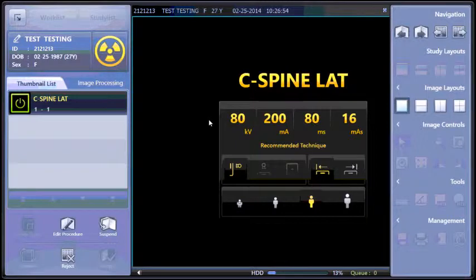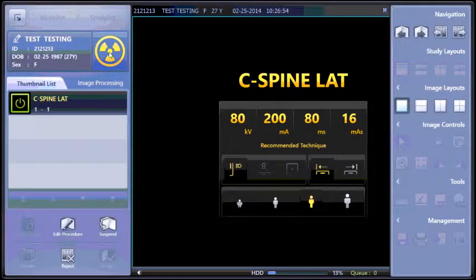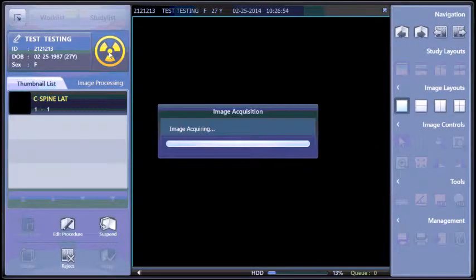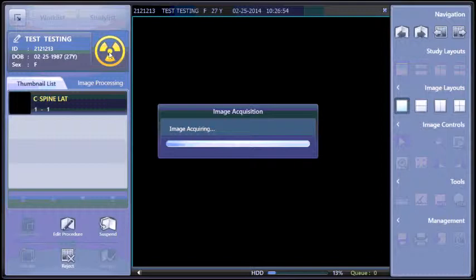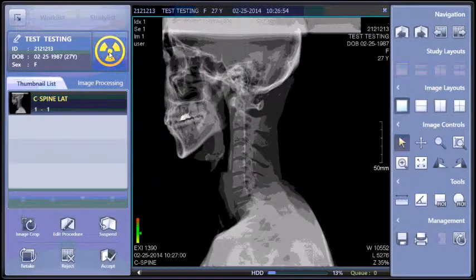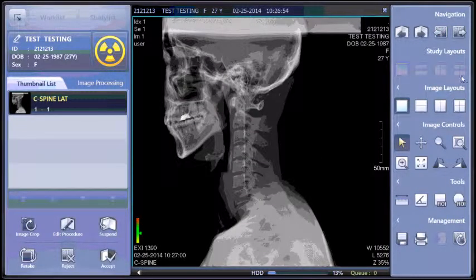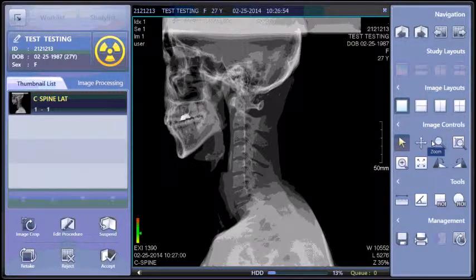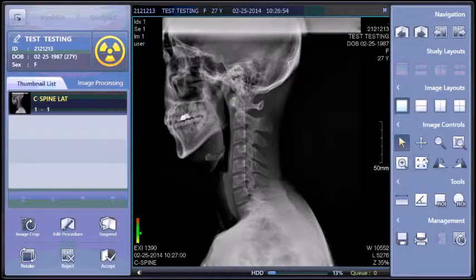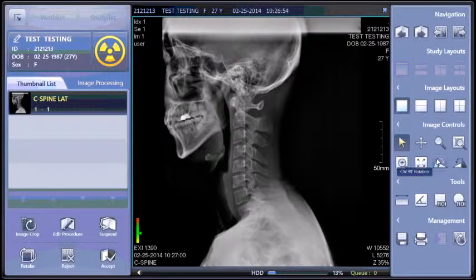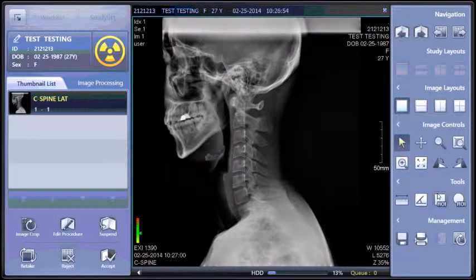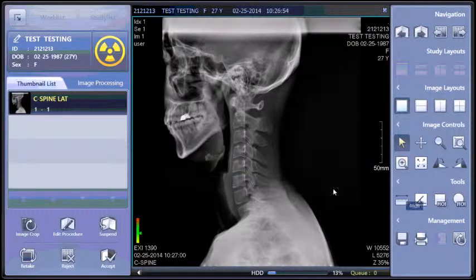Now you are ready to take your x-ray. Once the image appears on the screen, use your toolbar on the right-hand side to zoom, pan, crop, invert, window level, and so on.